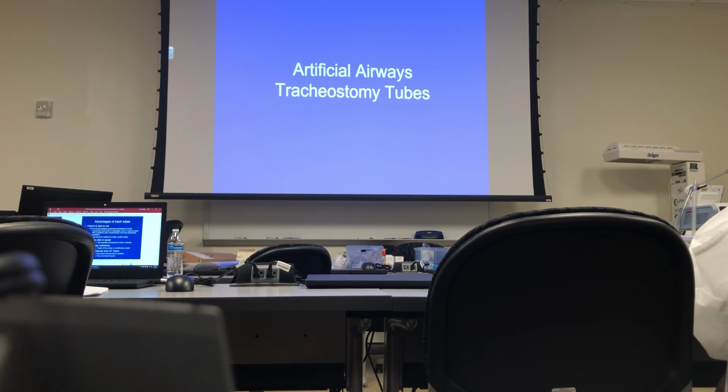Put your hands around there. All right, now you're gonna let out air until it drops to about 30 centimeters of pressure. You keep your hands around there. You feel the cuff deflating? Now, there you go. You just loosened too much. Oh, have it the way you had it before. Okay, let it out till there's, all right, so you see how that cuff is deflating? Yeah, I see. So that's my tracheal wall right now.